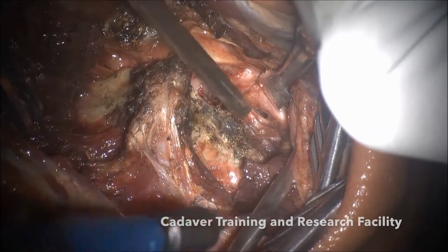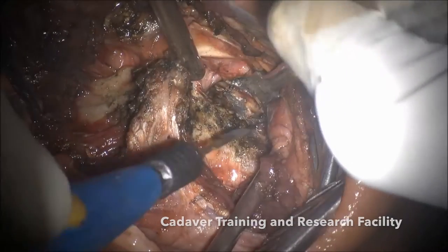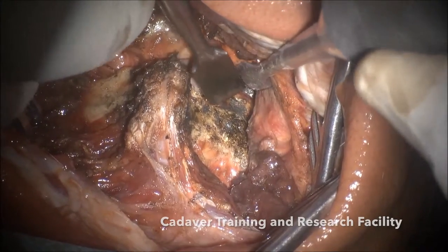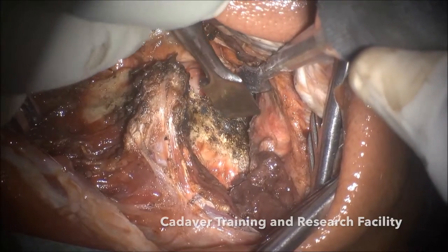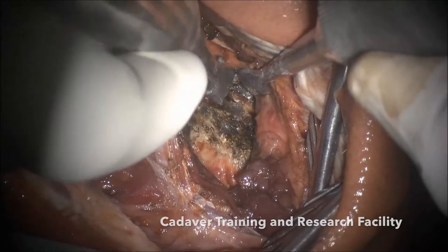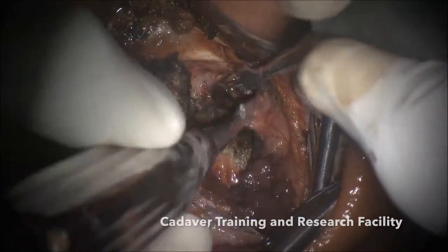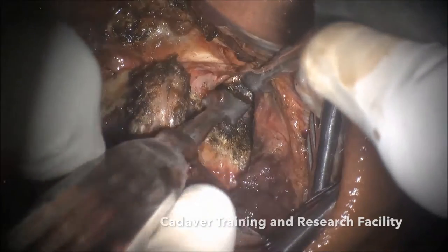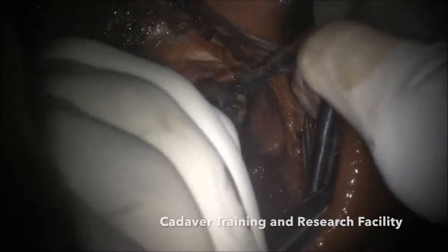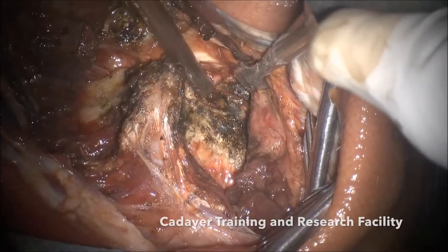Now you have seen the joint getting exposed. You can see the joint now — this is the lane, this is a sharp lane, it is a small lane which turns and now becomes the highway. This is the lateral part, this is the middle part, and this is the house which is actually the facet joint. The base of the house is the joint; you can open it up like this and also drill it.